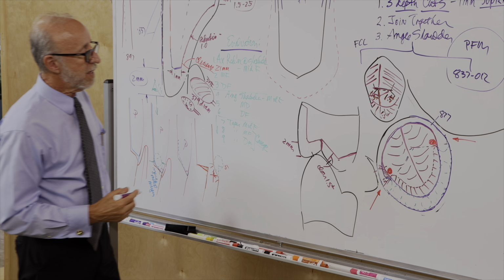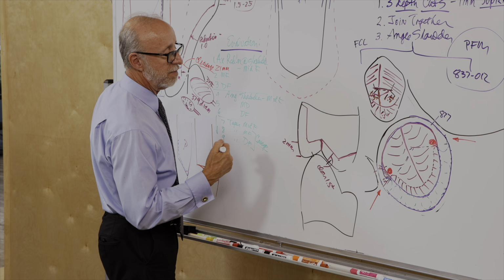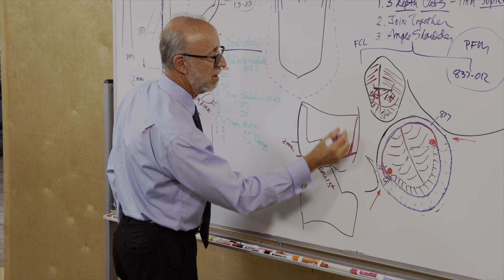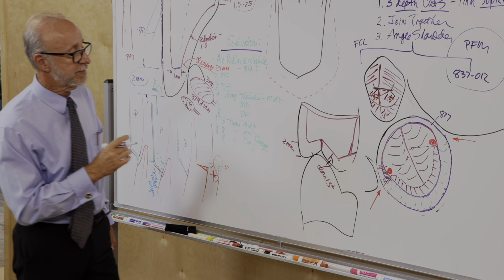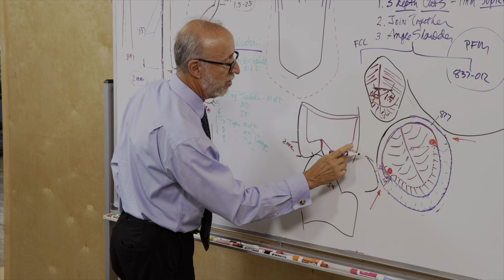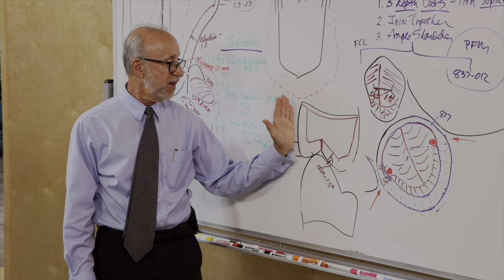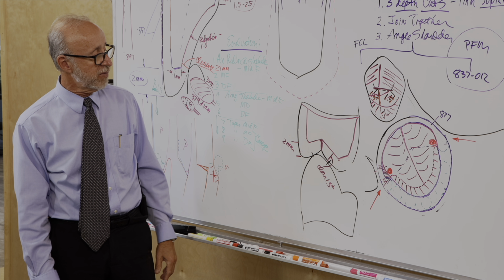Okay, so there are a couple of new concepts, a couple new measurements, but basically the rest of it's the same as we normally do. Chamfer on the lingual, secondary plane on the lingual, chamfer through the proximal, join the shoulder on the facial, and we finish the prep. So again, the posterior teeth, there's a little bit more to look at in terms of occlusal reduction. But again, it's a combination of occlusal reduction and facial axial reduction that gives us the facial cusp reduction that we're looking for.